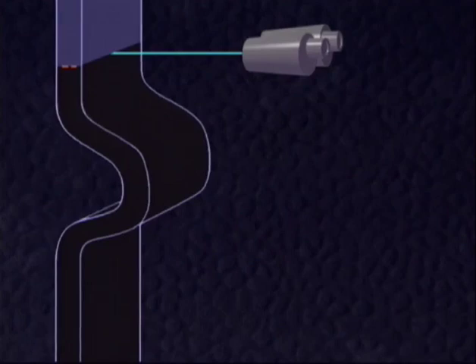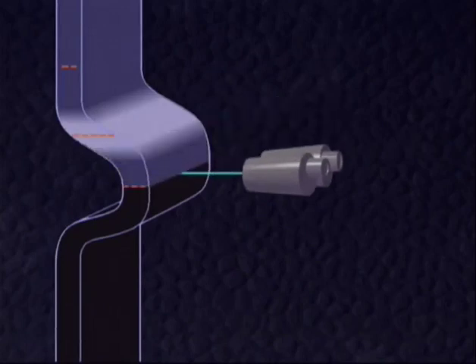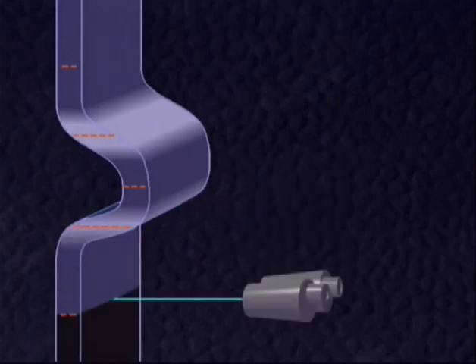Let us look at this again by the example of a fold. Where the tissue is observed perpendicularly, it appears milky transparent. Where met obliquely, it appears whitish opaque. Here at the top, it appears transparent again, here again opaque, and here transparent. Such folds can be produced artificially by scleral depression and may be used for improving the interpretation of findings, at least in the peripheral fundus.